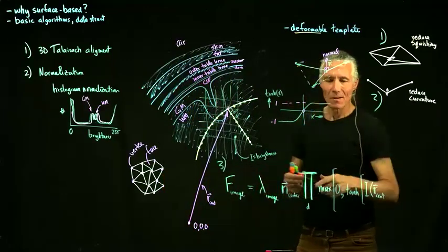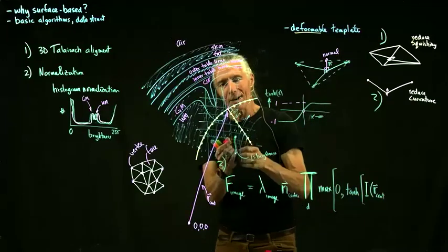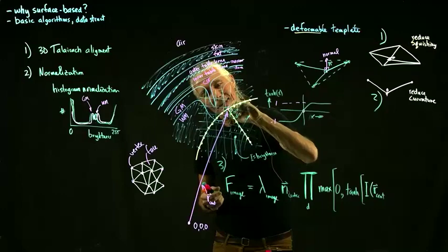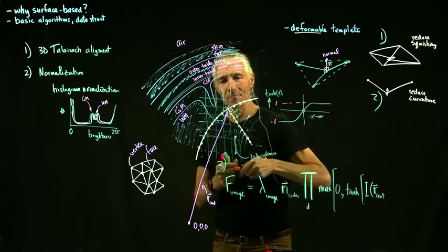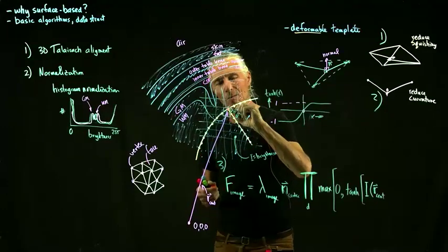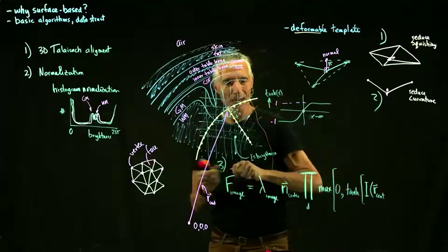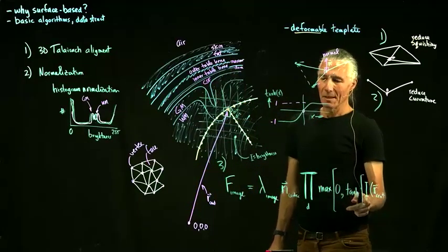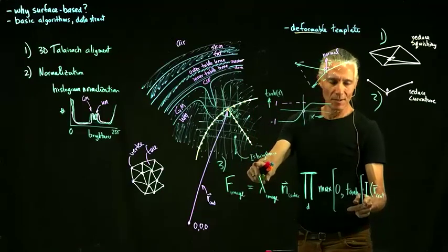And what does I of R mean? I of R just means whatever voxel that 3D coordinate was in. So you can see here's that 3D coordinate. It was in that green voxel that I outlined, and so that's the I, the brightness of that particular voxel.